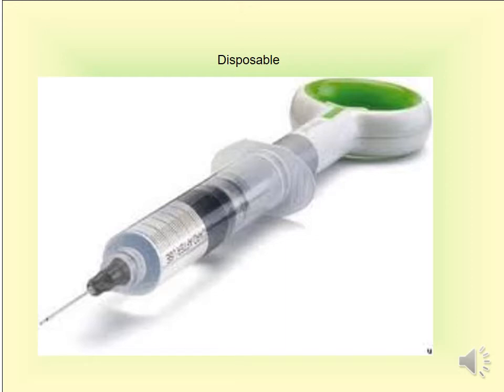The last type is the disposable syringe. The disposable dental syringe is not used very widely in the clinic, but in remote places, meaning in rural areas where we need more than one syringe. Sterilization there is difficult, so we use a disposable syringe instead of the metallic type.